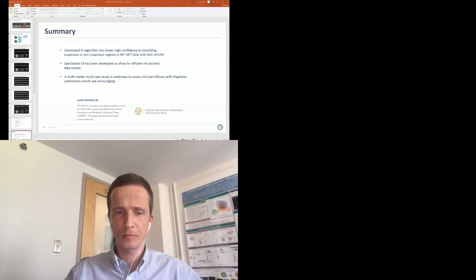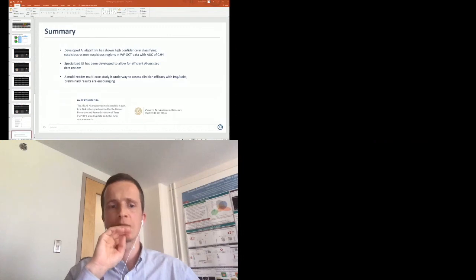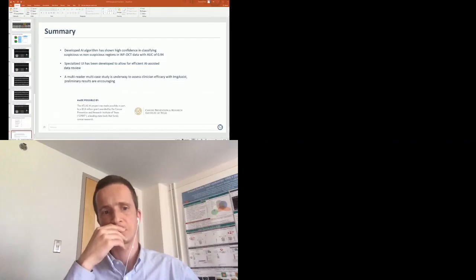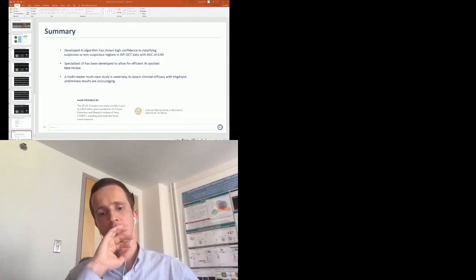So yes, first of all, the whole process is two-dimensional, right? Because we extract patches from B scans. And the clinically relevant depth is 2 millimeters, and this is where OCT still offers enough feature information to be able to proceed. The surgically relevant margin is also about 2 millimeters.